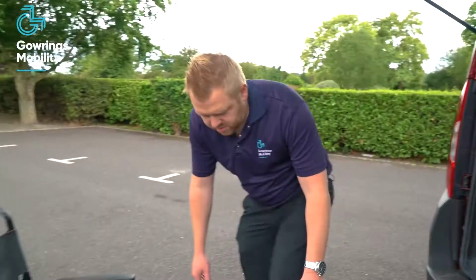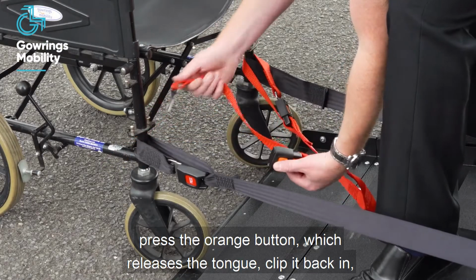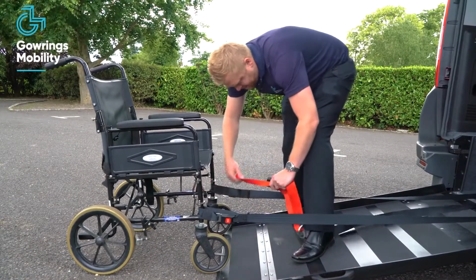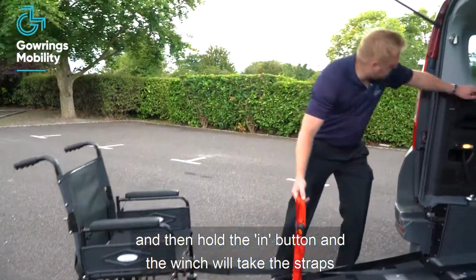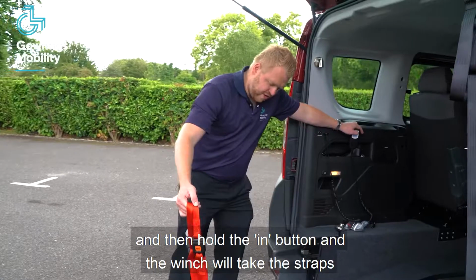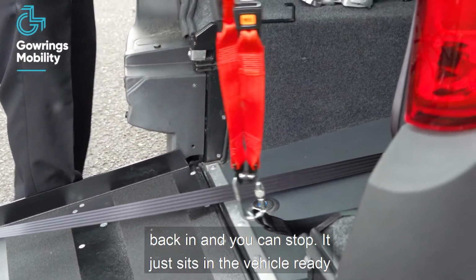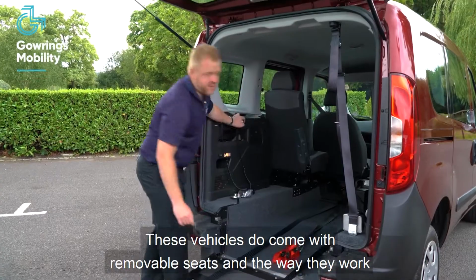To release the belts, press the orange button, which releases the tongue, clip it back in, do exactly the same on the other side, and then hold the in button and the winch will take the straps back in, and you can stop it just as it gets in the vehicle, ready to be used for next time.